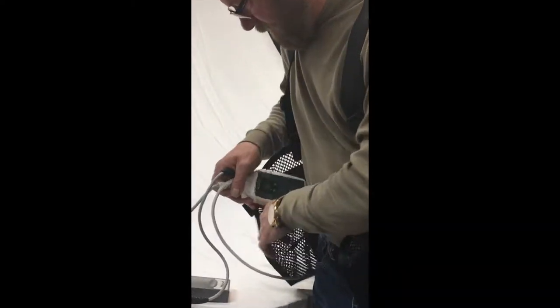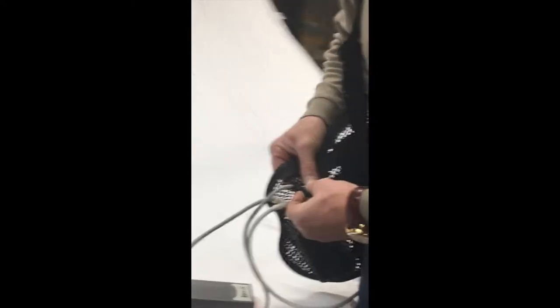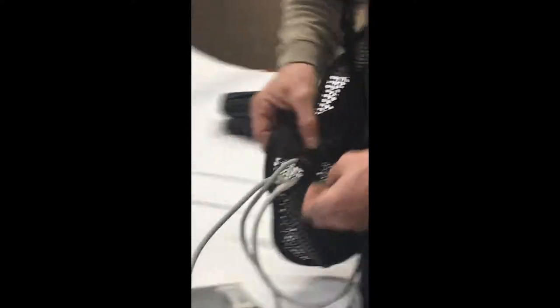Our LVAD Vest comes with a controller pocket on each side. I'll put mine here on the right, and then the seal's shut with a little piece of elastic that goes around a button.